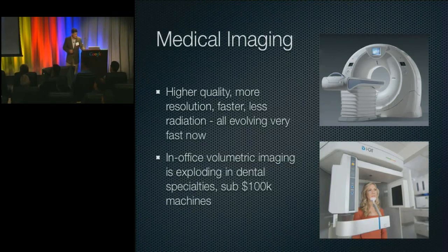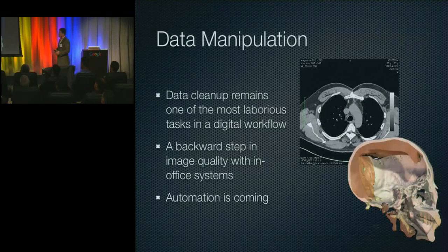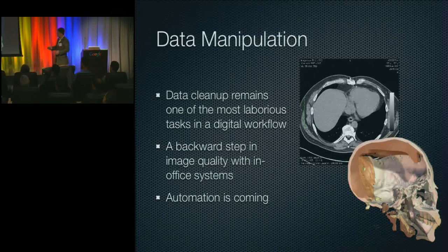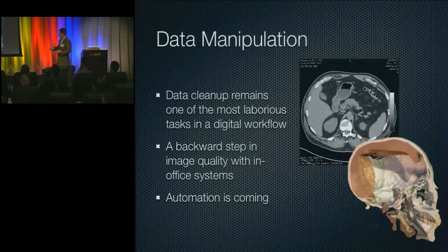So medical imaging is moving a lot, which is guiding the need to do manipulation. The next step for what we're doing, we'll talk about many different applications in a minute, but in the end, you've got to take data from a CT that might look something like this, and extract only what you really need to see out of it. Here we're seeing all kinds of things, from the spine and the ribs to all the internal organs and the soft tissue. For this particular case, maybe you only need to see the kidney, or this vessel, or this nerve as it enters the spine at this level, or this part of the skull, relating to something else.